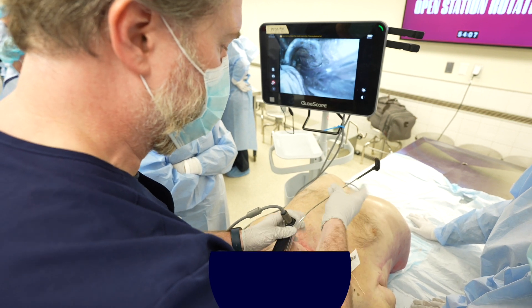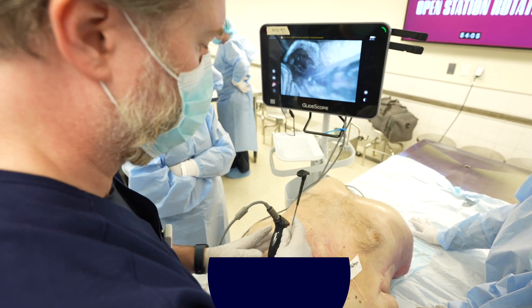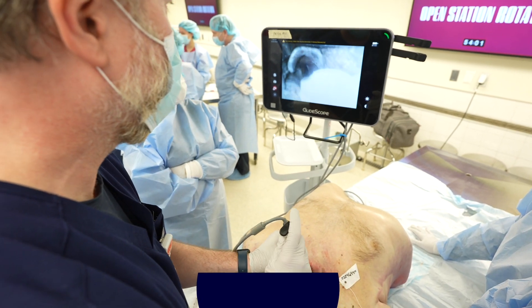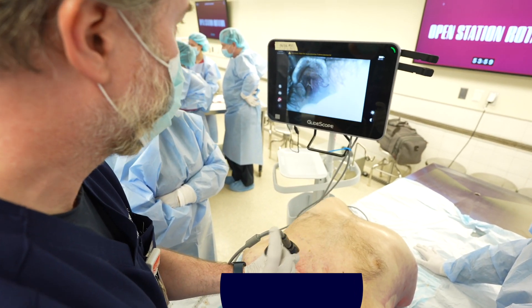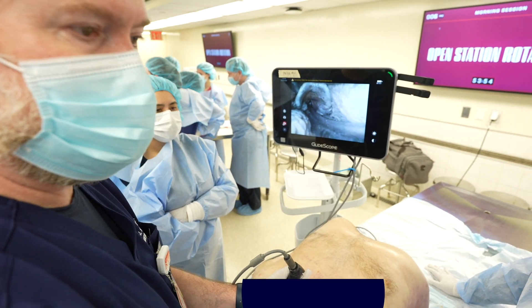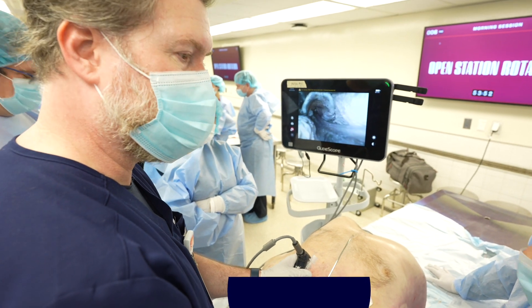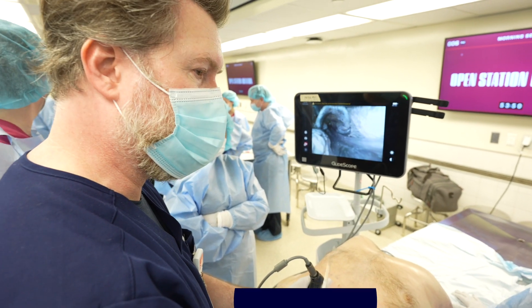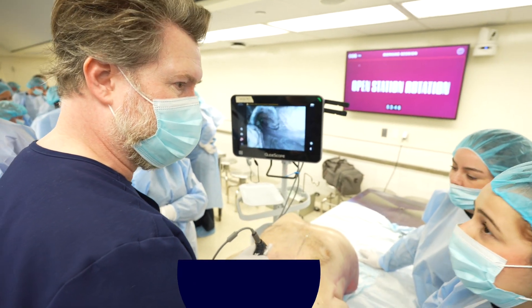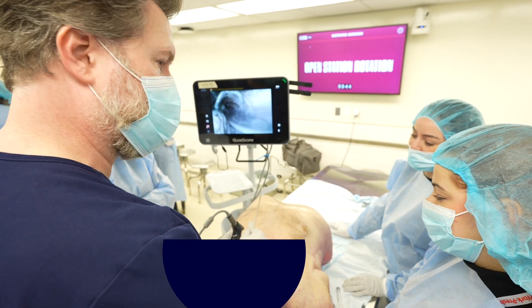When I do it all together with a good view, it looks something like this: seat, flip, tube — and it takes about a second. It's much more effective, and if you can integrate that into your technique it'll just supercharge the speed and efficiency.